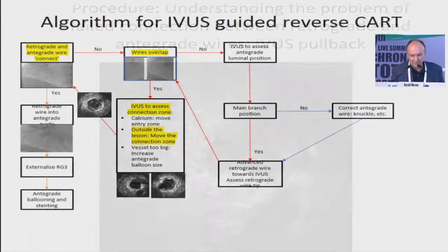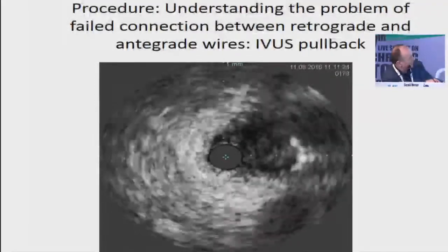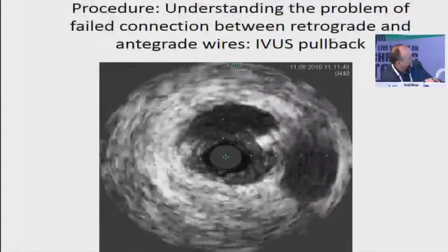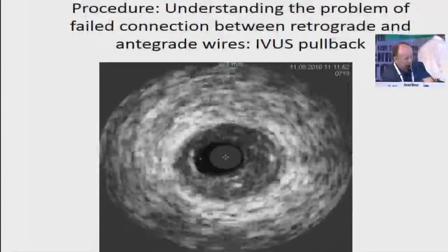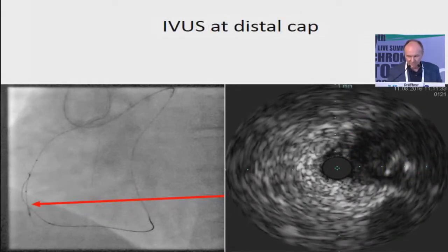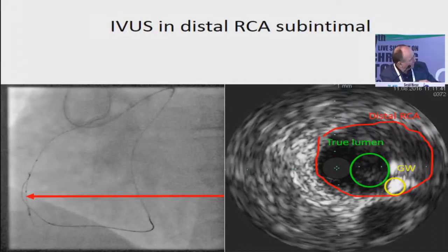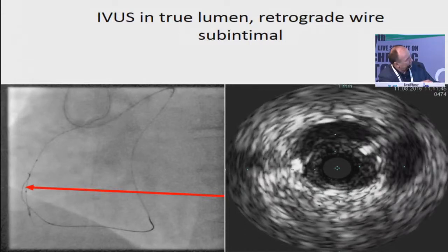In this situation the wires are overlapping, so I need to understand the connection zone — what is the problem, is there calcium? This is the IVUS image. This is the small branch, this is the RCA coming from distal. Now we realize where our wire is — it's coming here, you see the typical shadow, and it enters into the vessel structure but inside the plaque, then leaves and gets into the sub-intimal space. So I have to redirect the wire. Here is our target — the guide wire, then a little bit further up we have the true lumen but the guide wire is outside, transiting into the sub-intimal space and clearly outside.